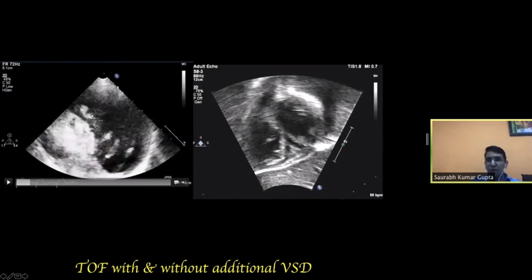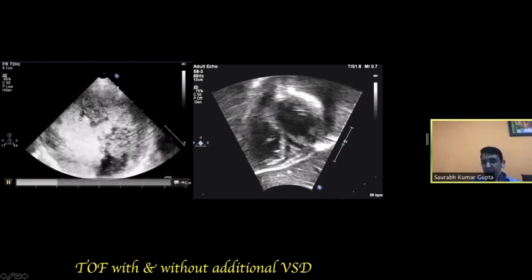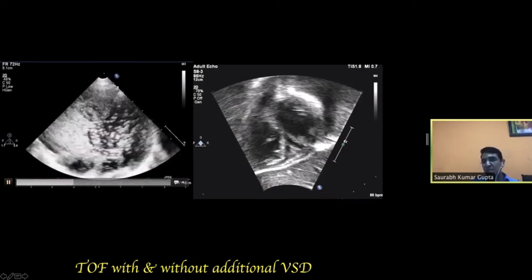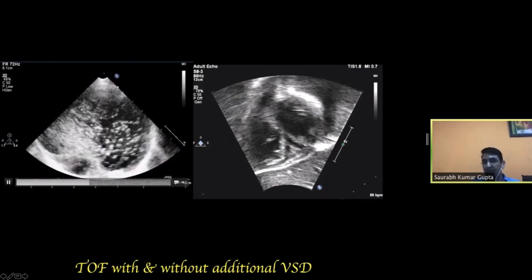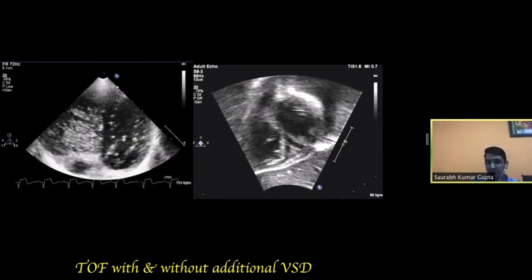So if you see over here, this part of the LV is getting filled by some contrast, but where does contrast appear in this area? That is how you analyze angiocardiograms. So similarly, you analyze your saline contrast echo, and then if you analyze it well, you will realize that there is something in this distal part of the septum. And once you have suspected, I think it is not so difficult to confirm or refute a diagnosis.